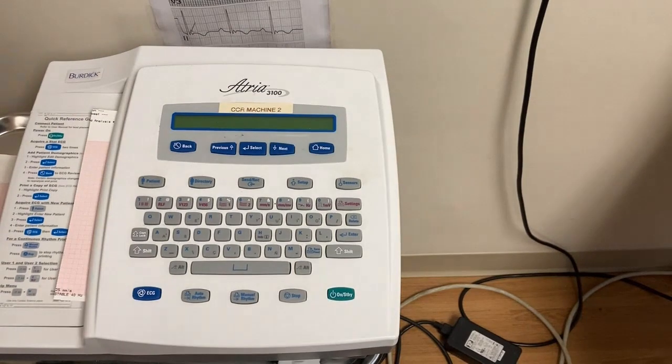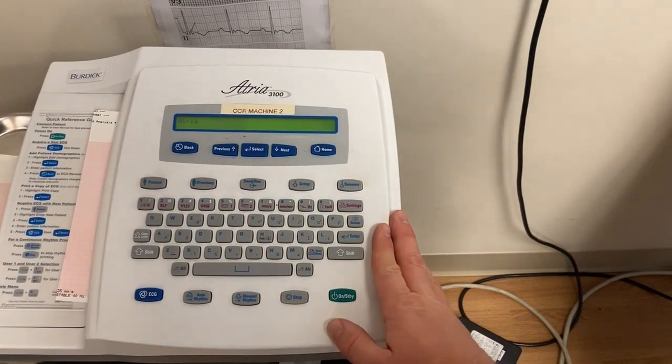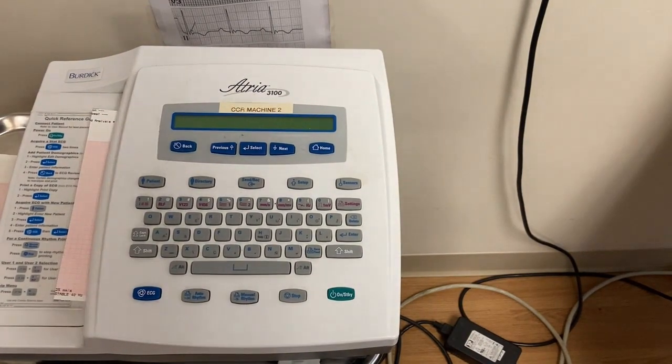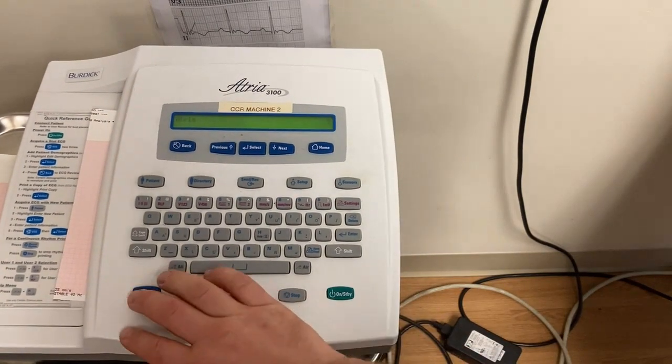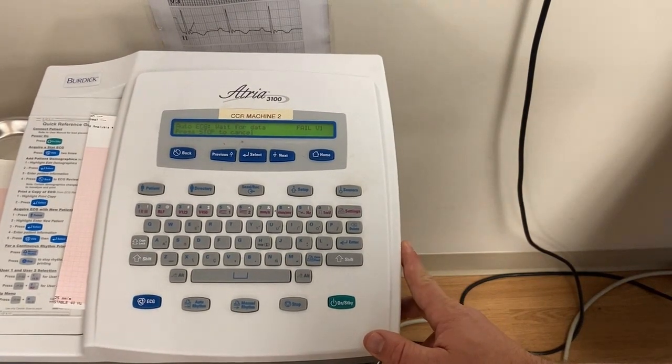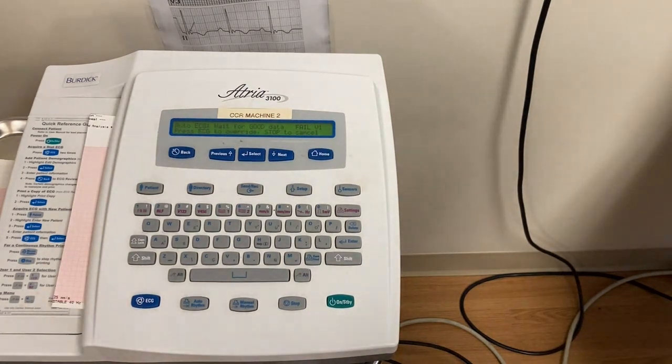Now for the EKG machine itself. First step: turn it on by pressing the on/standby button — the machine will do some checks. In an emergency situation, push the EKG button twice to print. Your heart weighs about 300 grams, but the patient's arms and legs have much more muscle than that, which can cause artifact. To prevent this, have the patient put their hands under their butt — sitting on their hands.